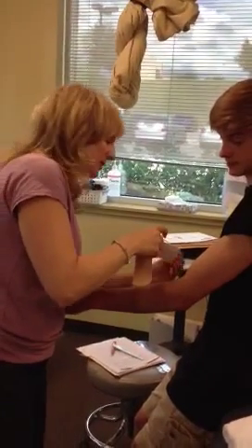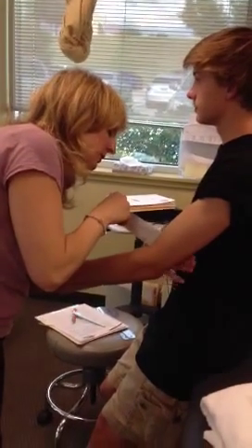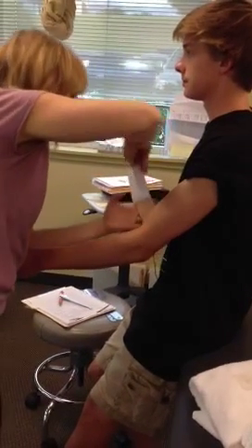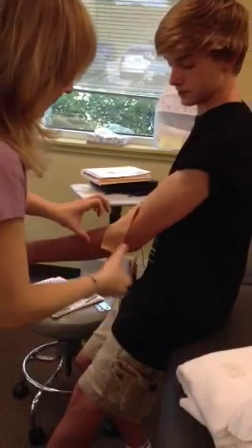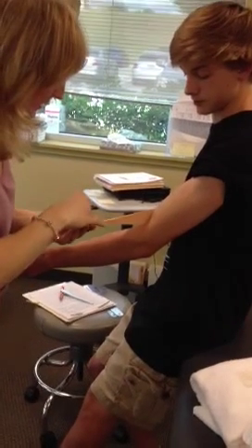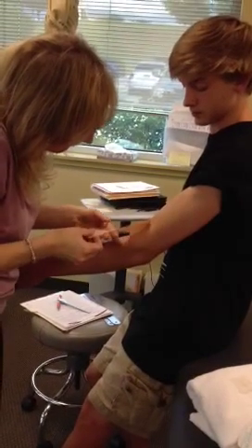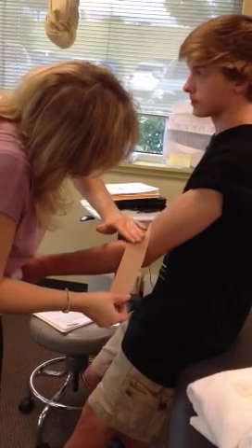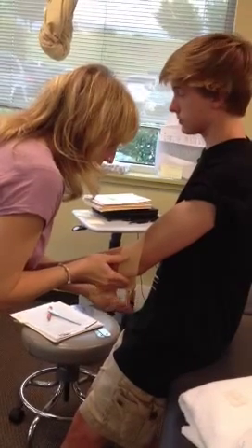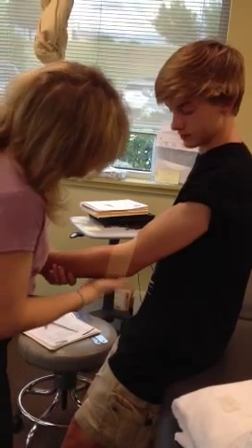So I start from the inside of his elbow, just above the elbow, kind of on the back of the tricep. And I'm going to give a 25% stretch in this angled direction, going over the radial head to add some stability and support. Then I leave the last little bit as an anchor, just loose, and slide it on. Then you rub it in order to activate the kinesiology tape.